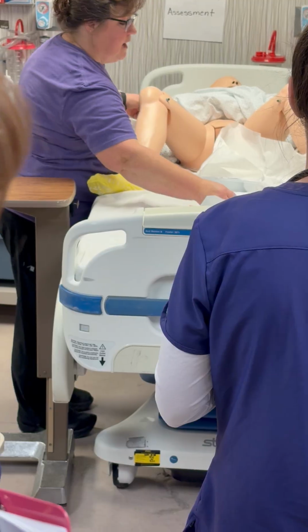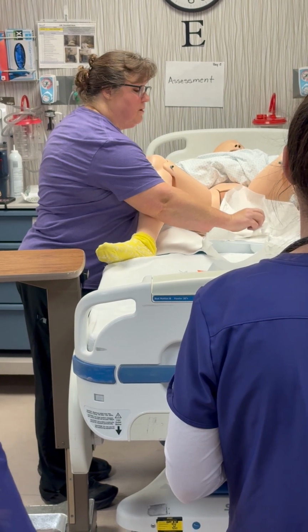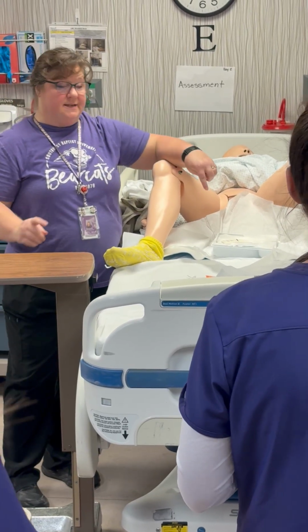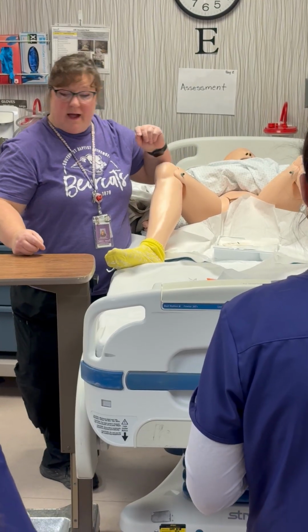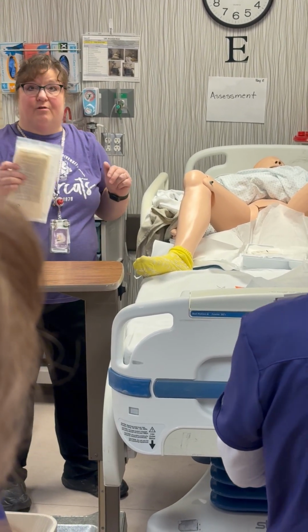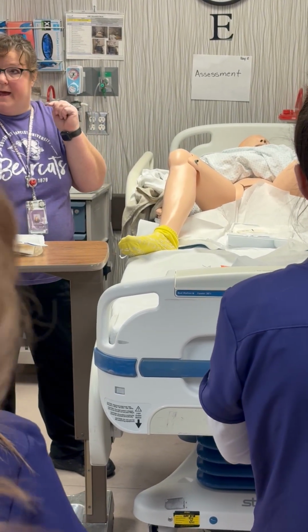Okay, now I'm starting to get into that sterile area, right? So I have to be very careful. So now I'm going to pull back toward me, okay? Keeping that inch border, okay? So now the first thing that I see is my gloves on there. Gloves come in every Foley kit. However, we want you to use your gloves because that's going to show us you know how to open sterile field, okay? So when you see these gloves, it should be, oh, okay, I need my gloves on, okay?